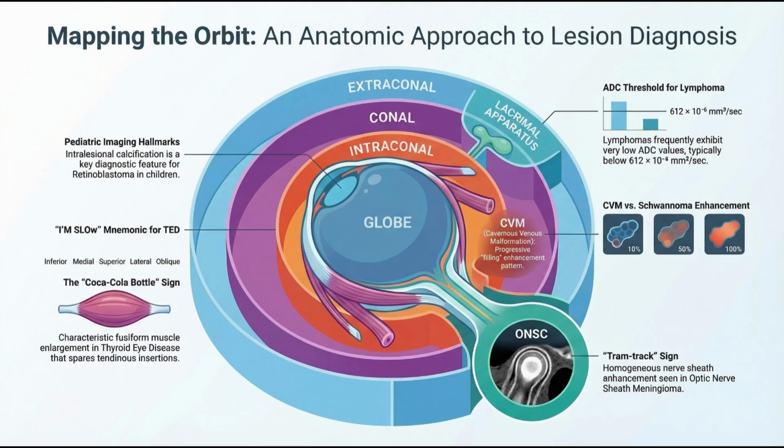Exactly right. But malignant tumors, like adenoid cystic carcinoma, don't respect those boundaries. They grow fast, and they are chemically aggressive. So they don't just push. When they hit the bone, they don't gently push it. They violently eat right through it. Radiologists see this on a scan as irregular, jagged bone erosion.